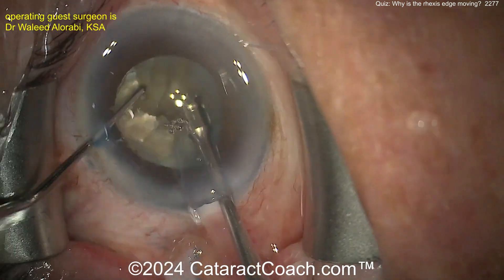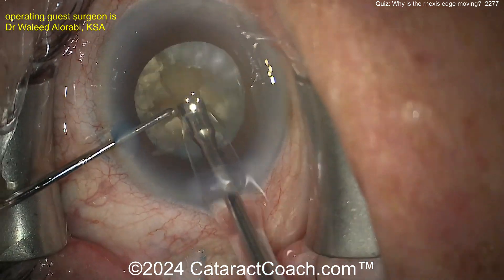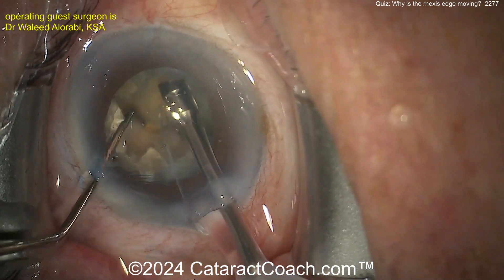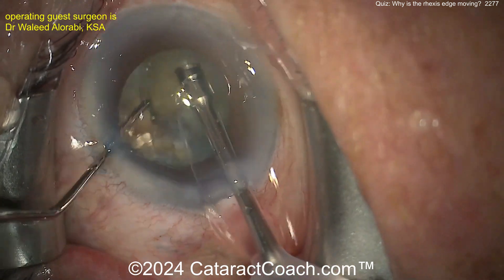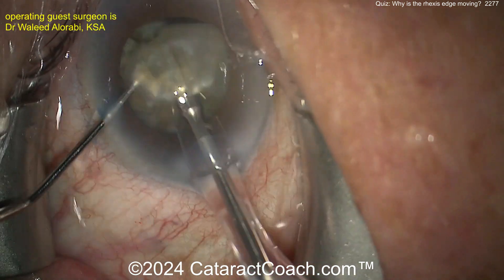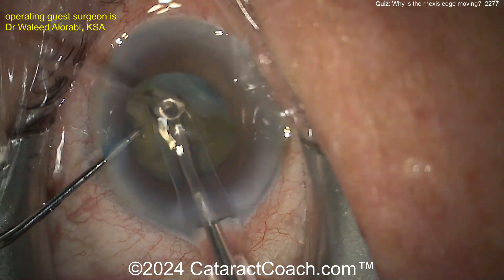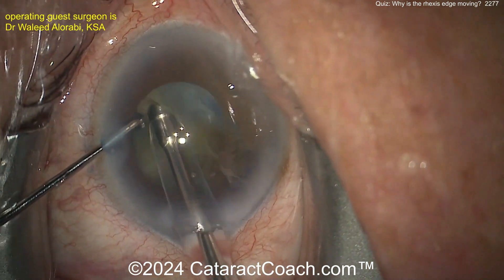But now look what happens — chopping a little more, starting to take the pieces out, and what you're going to notice is the rhexis is going to move. At this point the surgeon made the rhexis just about as big as the pupil, so you don't see much of the trypan blue stained anterior lens capsule. These white cataracts can have a fibrous appearance where it's hard to separate pieces. There comes a quarter brought up to the iris plane — now look, there's the rhexis. Why do you see that blue capsule there as the pieces are removed?